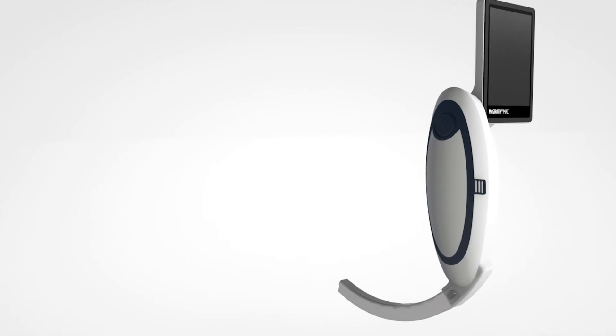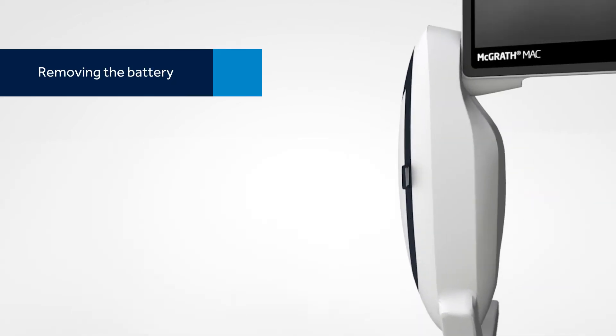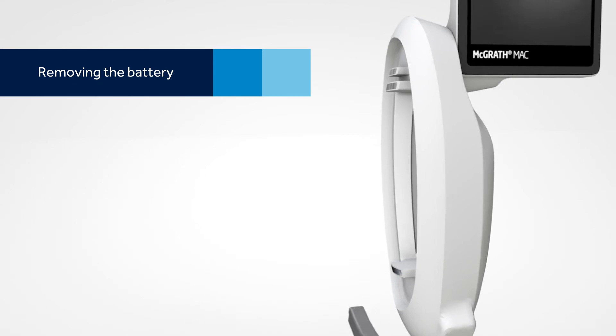All batteries come with 250 minutes of lifetime and are disposed after that time. To remove the battery, grip the rubber tab and pop the battery out of the handle.